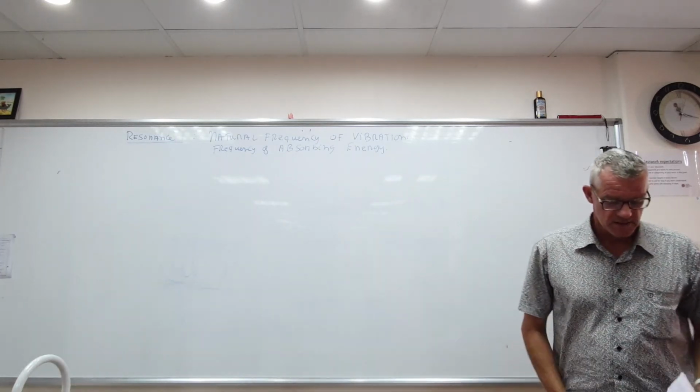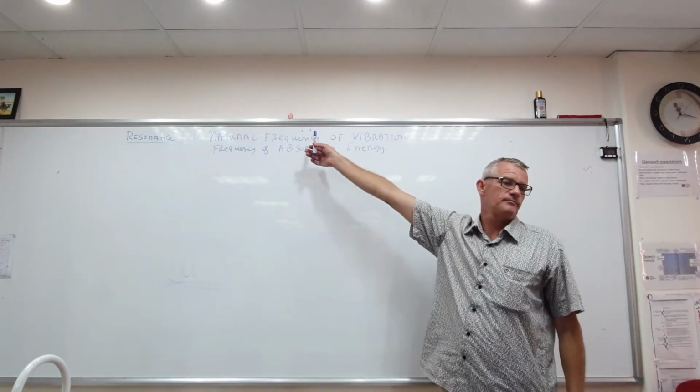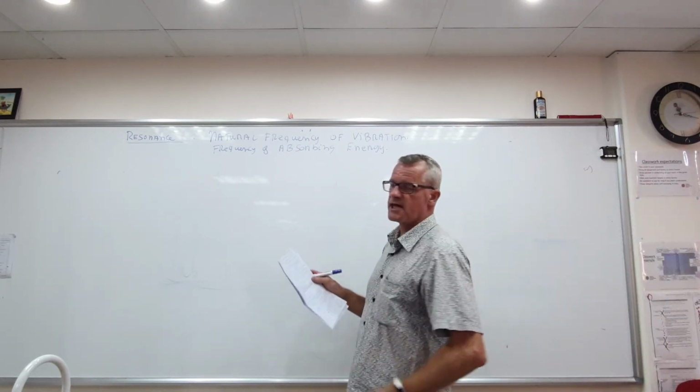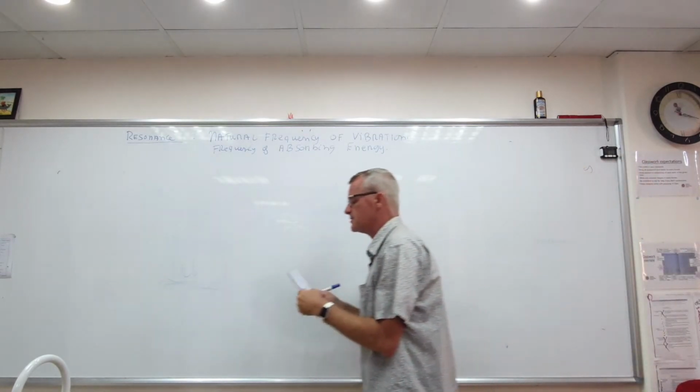Okay? So what the MRI does, it gives pulses of these natural frequencies. Yeah? So that is the same frequency of the precession that we discussed. Yeah?